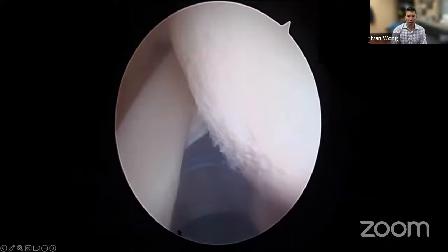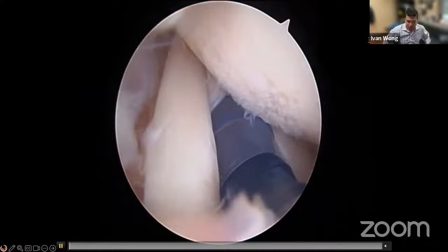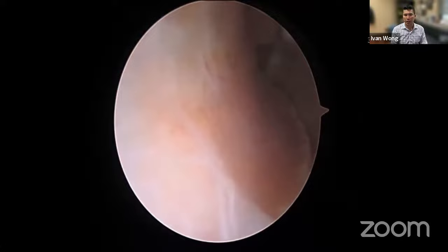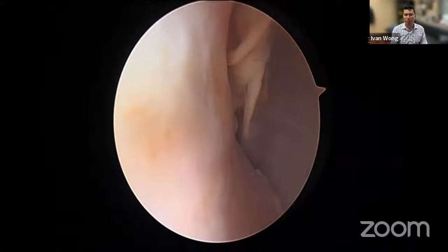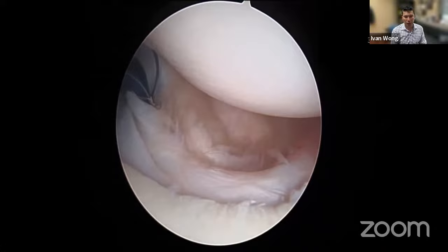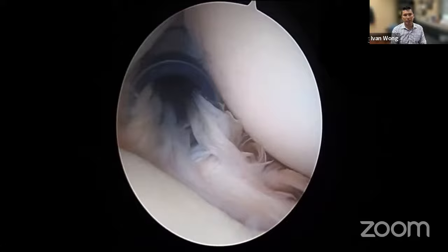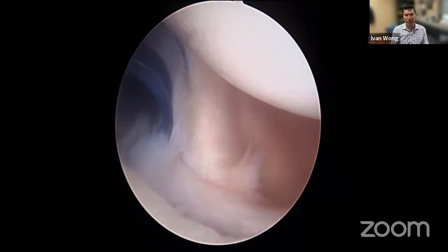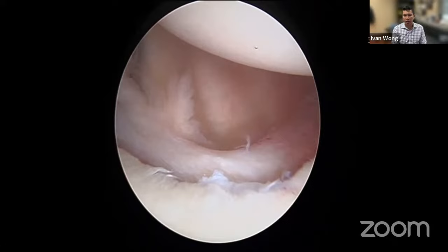This is an example case viewed from the posterior portal at the start of the procedure. This patient has dislocated quite a few times — there is a very large Hill-Sachs lesion. This surgery was done just a few weeks ago with my graduating fellow doing the operation while I guide him through the technique. Viewing from posterior, you can see the shoulder has to be reduced to keep it in socket. The blue cannula is the anterior inferior portal, placed well away from the anterior superior portal so we don't get any scissoring.